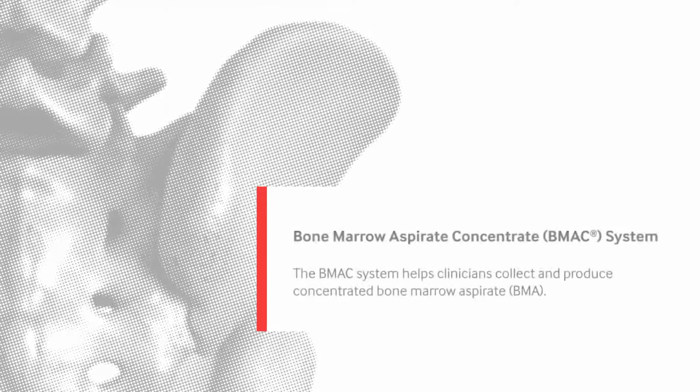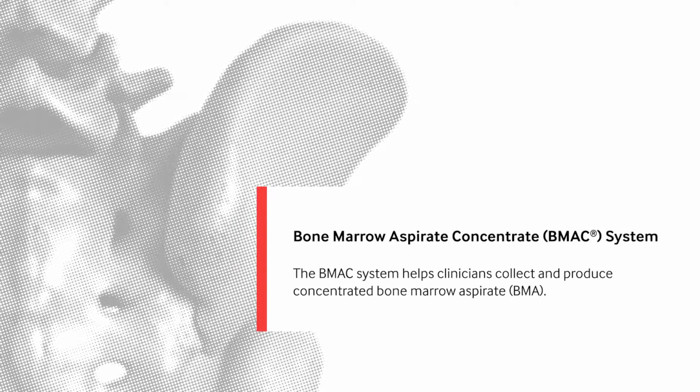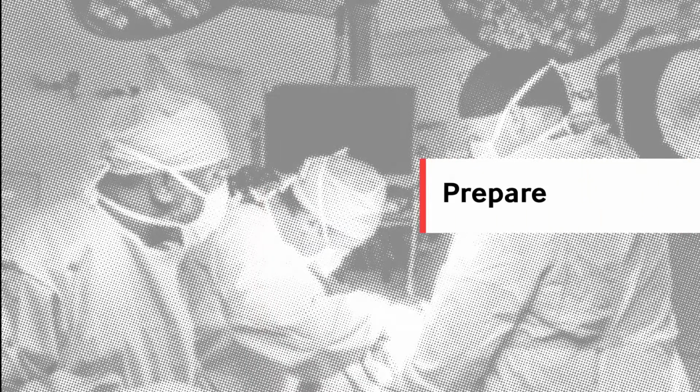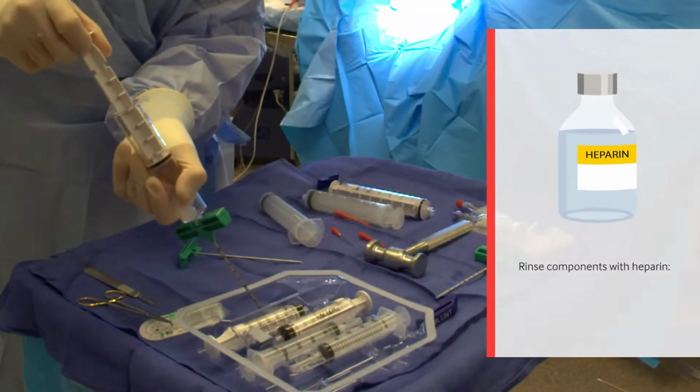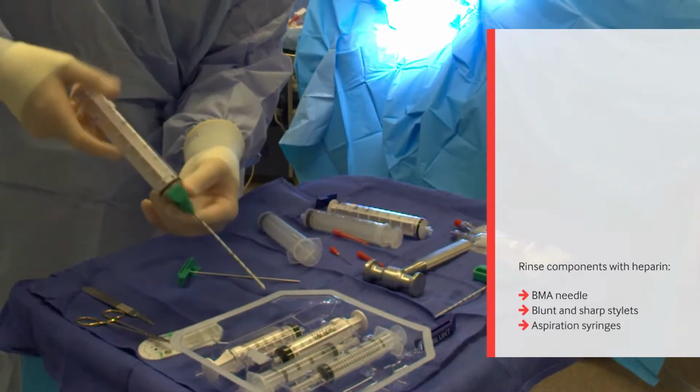The Terumo BCT bone marrow aspirate concentrate system helps clinicians harness the autologous biologic potential of bone marrow aspirate concentrate. To prepare for this procedure, rinse components that will come in contact with bone marrow aspirate with heparin.